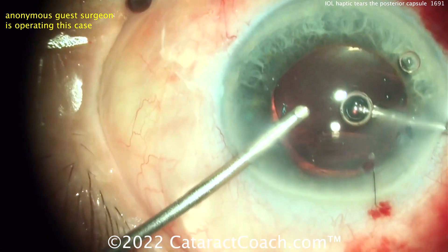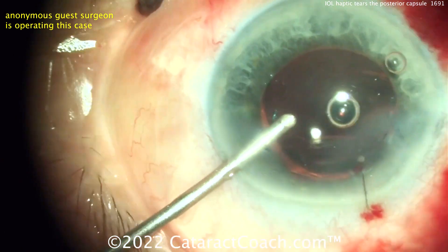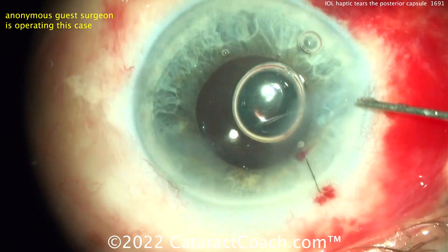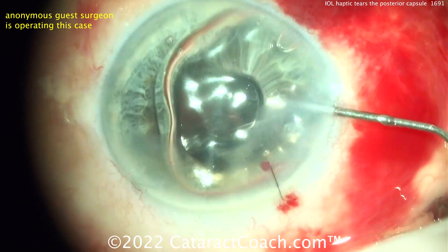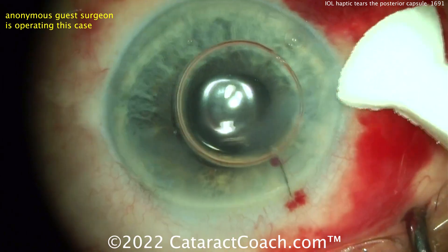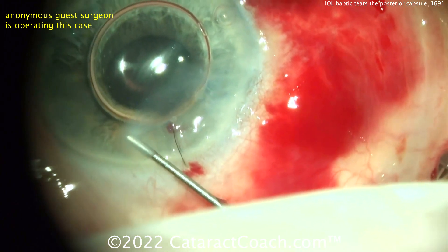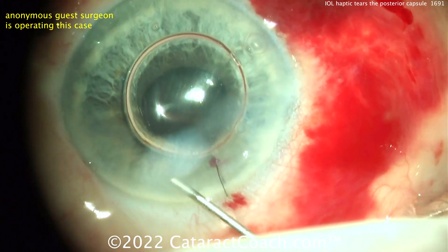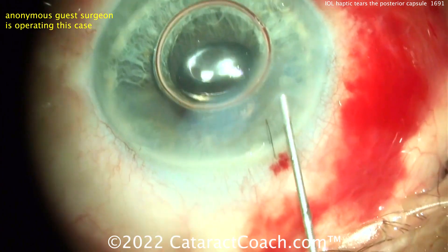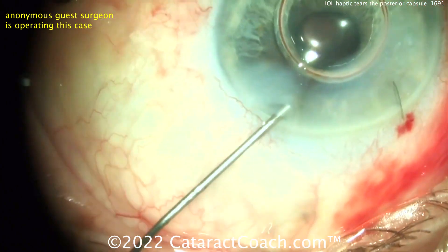Lucky it is a three-piece lens, so sulcus placement is an easy option. This goes to remind you that these eyes are such fragile, beautiful little organs — tissues are very fragile, and even something as benign as the IOL can end up rupturing the capsular bag. I want to commend this young resident surgeon from South America for recovering nicely — the patient actually had a pretty good outcome.